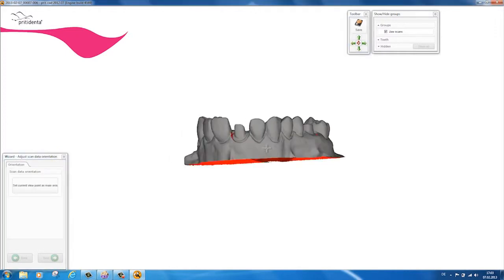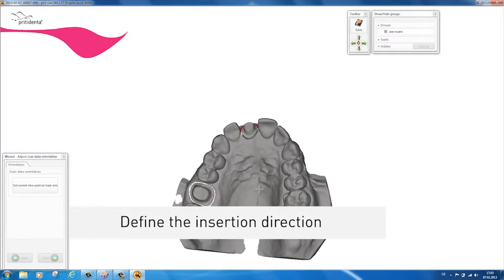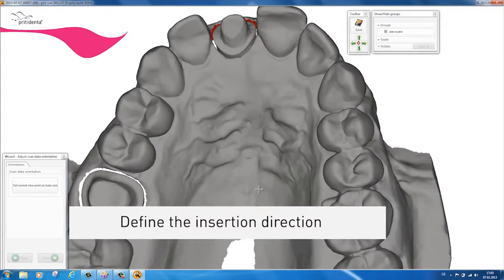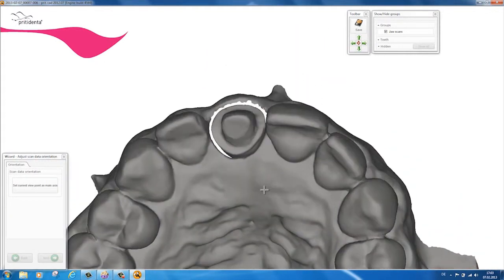When defining the insertion direction, the whole of the margin line should be clearly visible in the view from above.